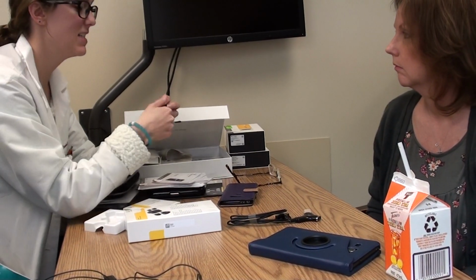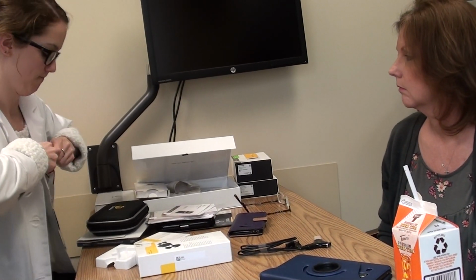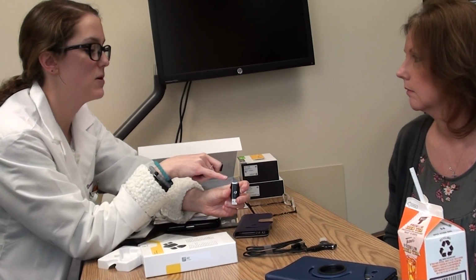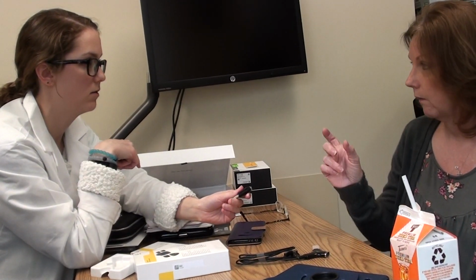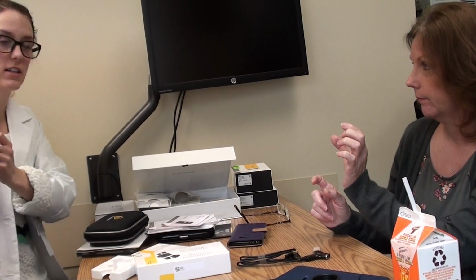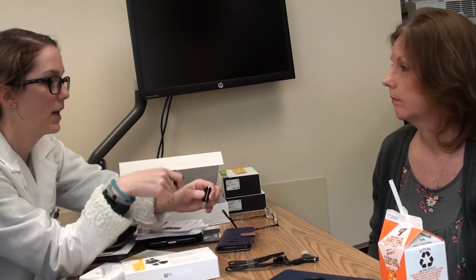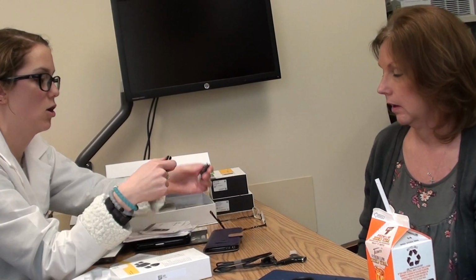You also have this. This is a travel charger. You can plug this into a USB and charge one battery on here. You mean like the cell phone charger? Or into your computer, anything like that. Anything that'll take a USB. You can plug it in and then the battery will charge on this. Oh, okay.